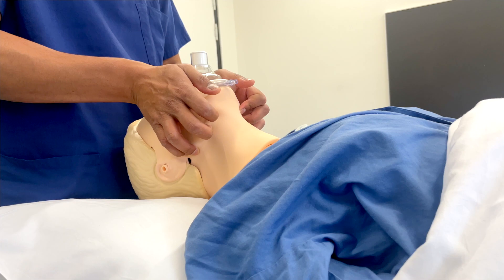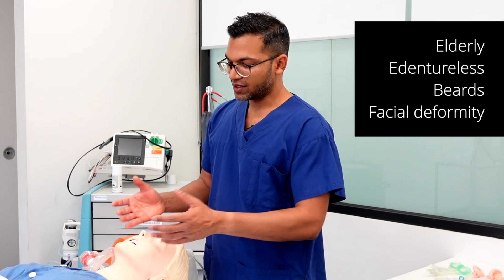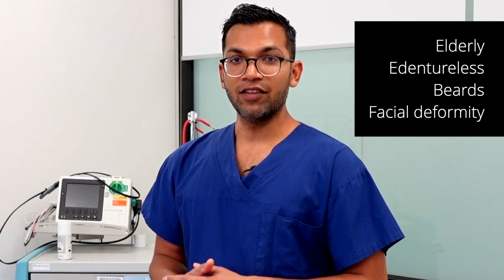A few other things can cause seal problems: elderly patients with drooping facial structure make it difficult to seal, and patients with a beard are really hard to seal. If a patient has other difficult airway indicators and really needs to be optimized — maybe they have hemodynamic compromise or are hypoxemic — I will ask them to shave their beard because it's potentially a life-and-death situation.